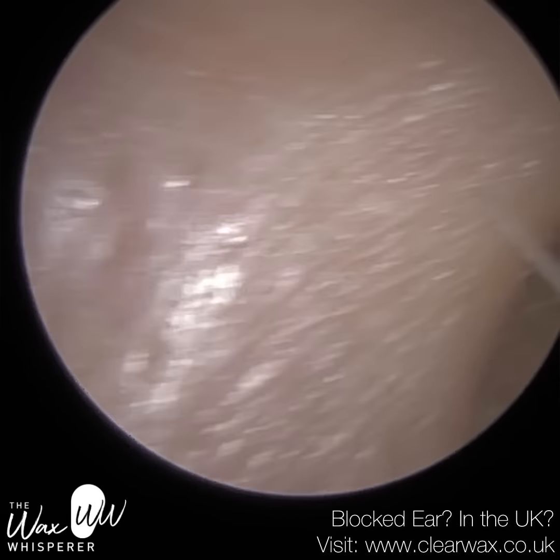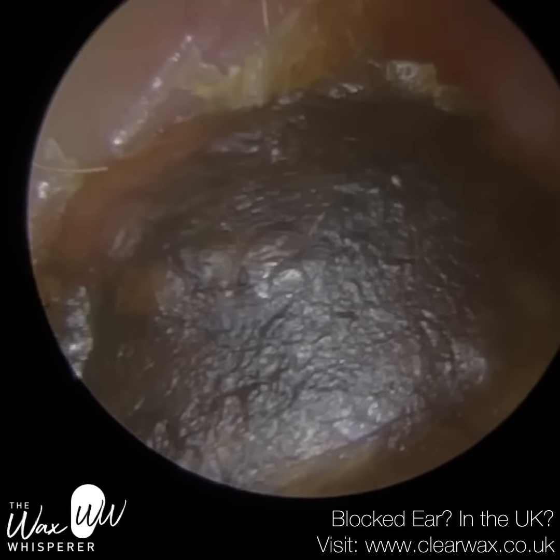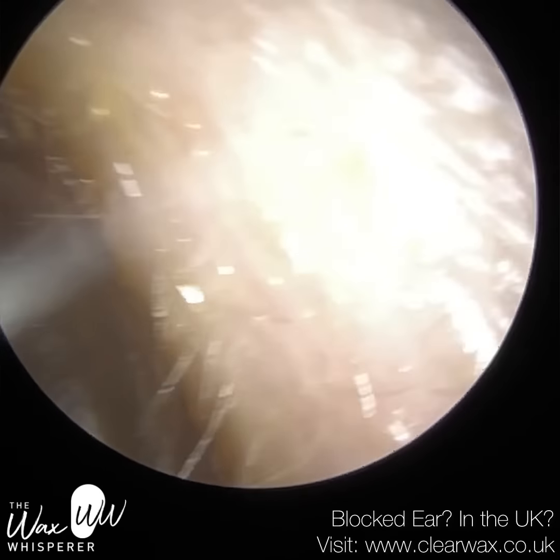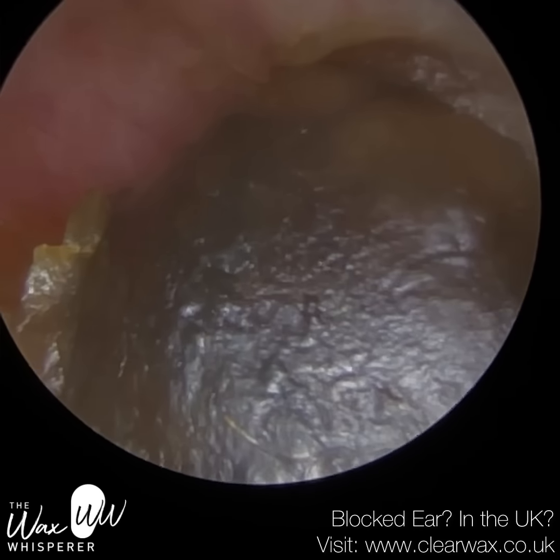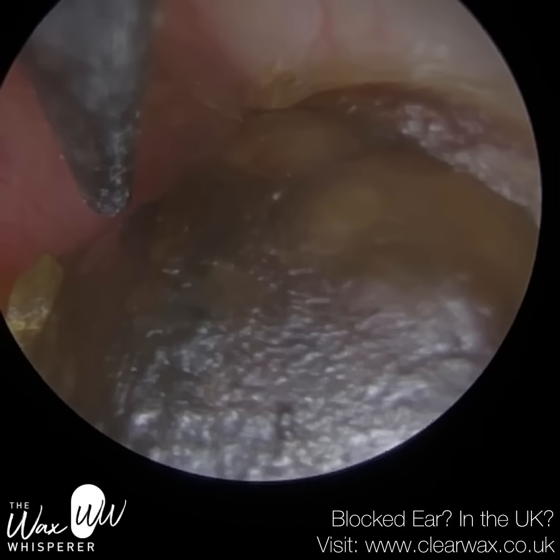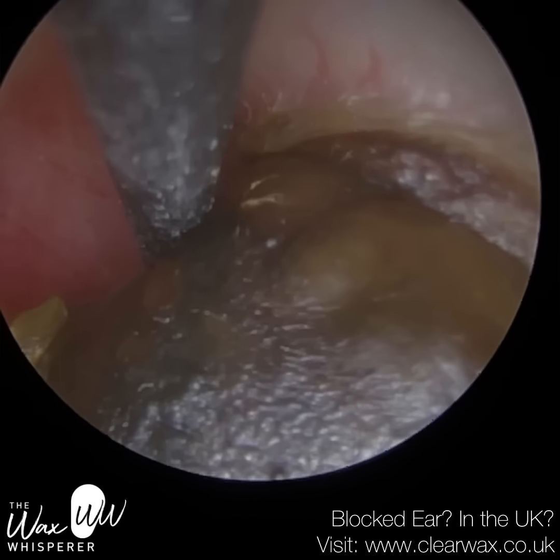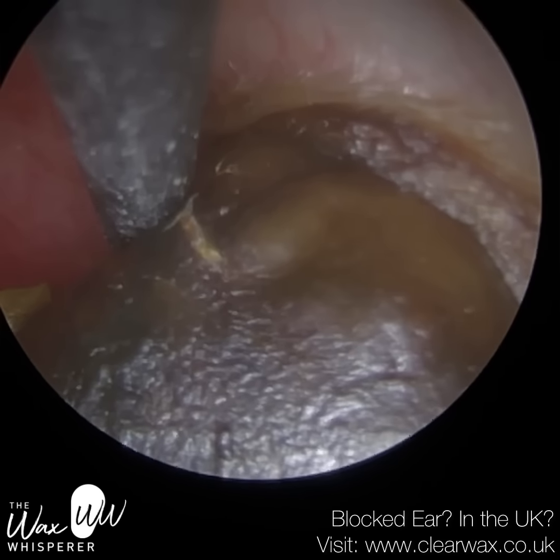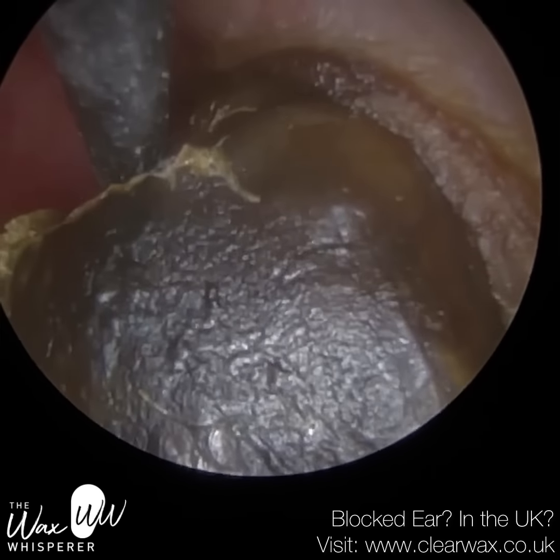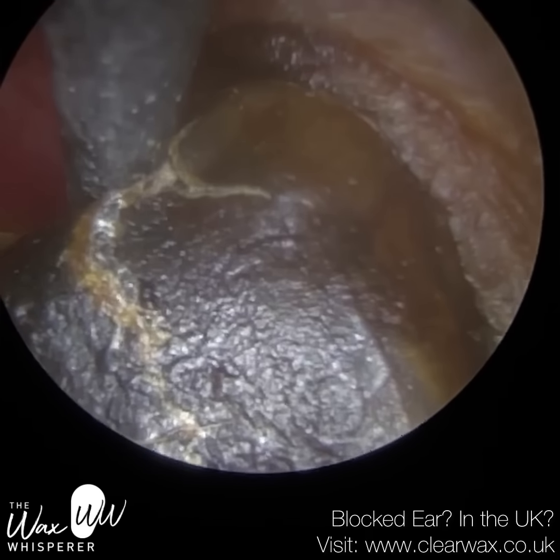We have here a patient who attended with a partially blocked left ear, as you just saw. They had this really hardened ball of matted keratin at the entrance of the ear, but I could still visualize the eardrum. But their right ear was fully occluding, and this ear has been giving them some problems of late. In particular, it's been causing some pain, sensitivity. The patient themselves were able to smell a foul odour coming from this ear, and they weren't sure if it was infected. Of course, their hearing has been reduced because of the occlusion, and historically, this patient used to self-irrigate his ears, or should I say self-syringe his ears.